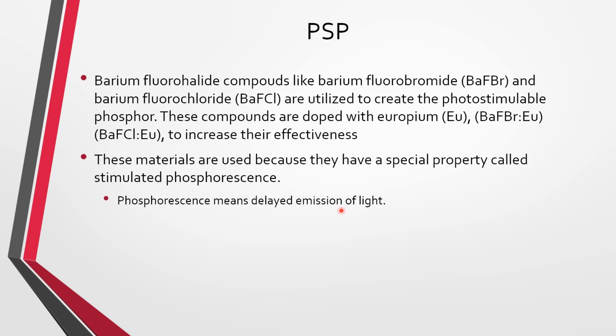Phosphorescence is delayed emission of light. Stimulated is when there's an energy put into it. Okay, and we'll learn about what that energy is in the next slides here. Sometimes the plates are called SPSs, which would be storage phosphor screens. That would also be what they may be called in some texts.